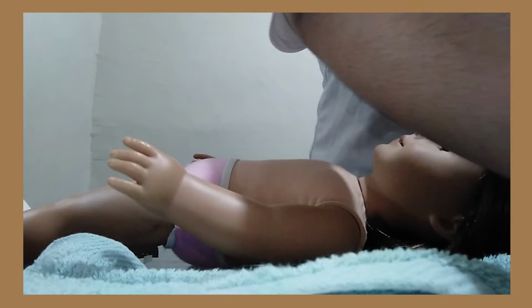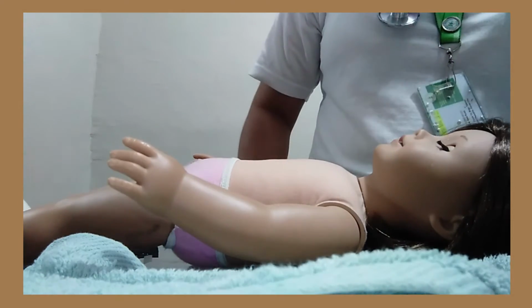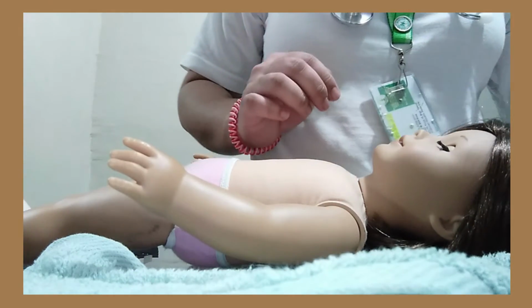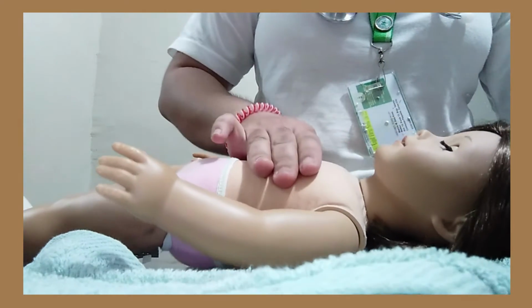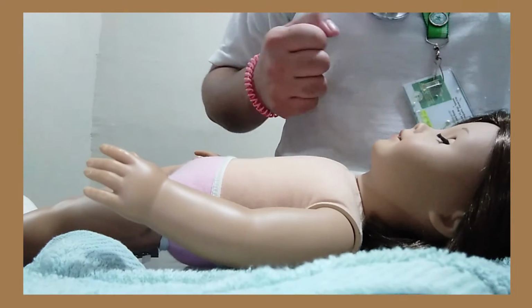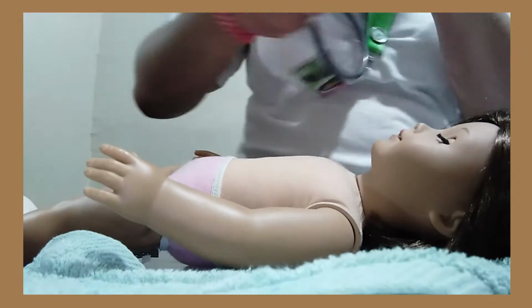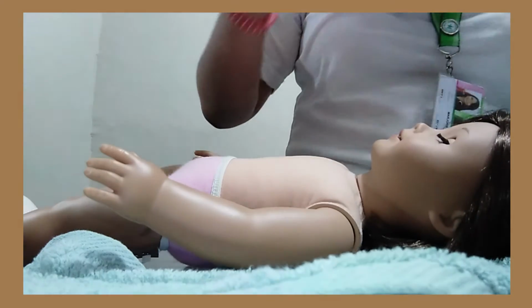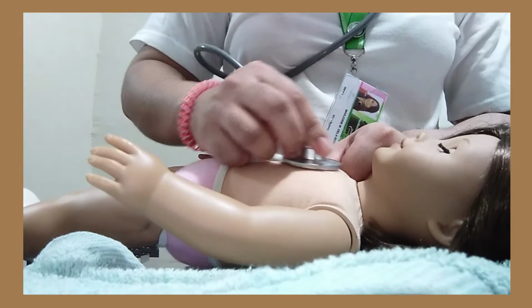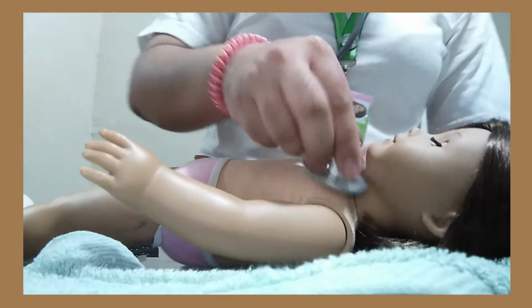Okay, so after this one, we're gonna be proceeding to the auscultation of the precordium. So now I'll be auscultating the precordium. With my left hand, I'm gonna be palpating the carotid pulse so that the systole and diastole are distinguishable. Okay. So now I'm gonna start with the diaphragm of the stethoscope, this one, the bigger one, and listen to the heart in the following sequence. First is the apex. Okay, the tricuspid area, the aortic area, the pulmonary area, and the carotid arteries there, just below the neck.